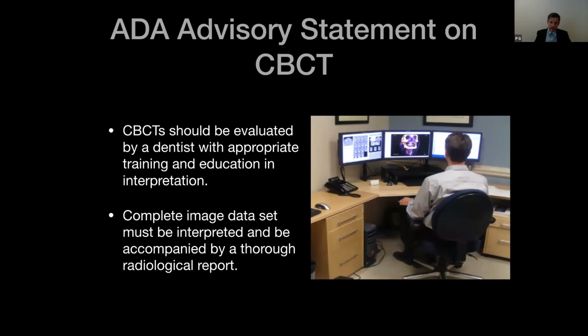And the entire scan does need to be looked at, not just the region of interest. But know this, all the dentist needs to do is to check if something's abnormal or if it doesn't look like it belongs. So no diagnosis, just recognition if something looks like it doesn't belong. So you're not necessarily responsible for knowing exactly what it is. You just need to make a call and either leave it alone, biopsy, or send the scan to another dental colleague or radiologist for a second opinion.